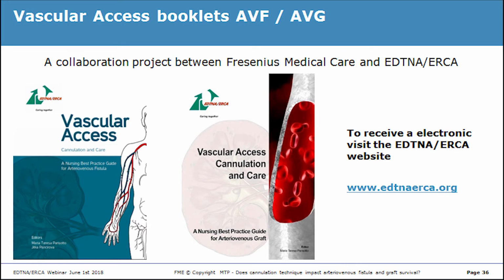To reduce the pain, you mean? To reduce the pain of the puncture? Well, but not only. There are publications discouraging the use of this type of cream, because you increase the risk of infections. I do not have really personal experience. I can only answer based on a few publications where this topic is mentioned, and it is not recommended in the publications that I have read for this reason.